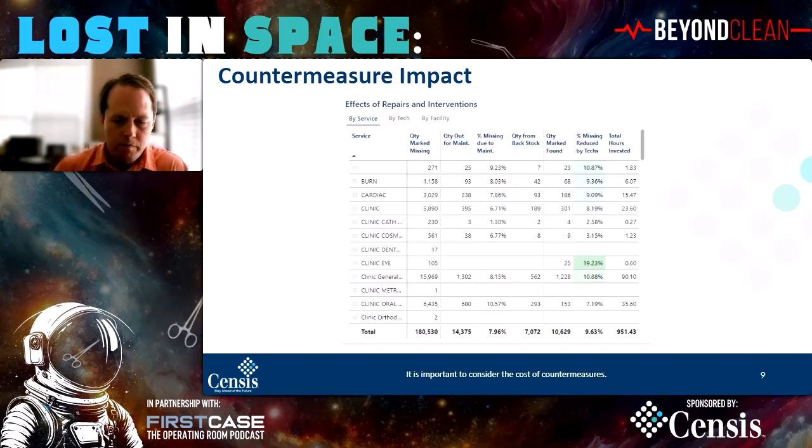What should I do? If they're only being evaluated based on the number of trays that they assemble, that technician may go, oh, well, I know the OR is going to be fine without this. I'm just going to mark it as missing, close everything up, and send it up, right? And so accidentally, we've created the wrong incentive here.